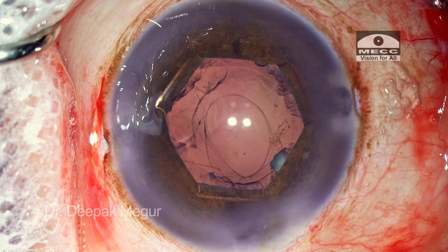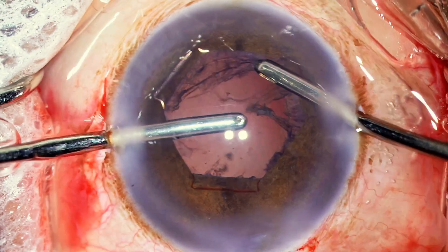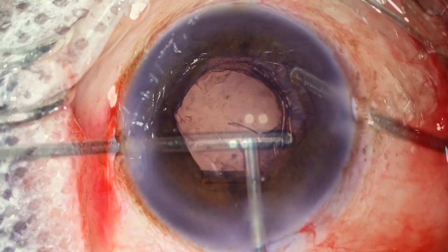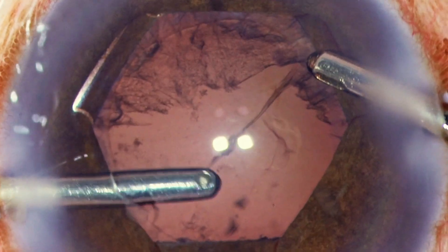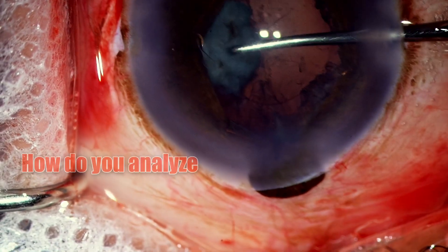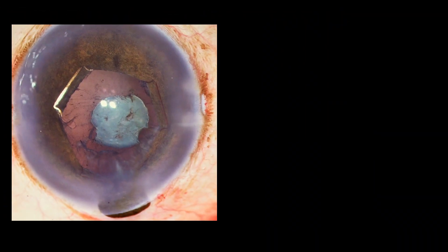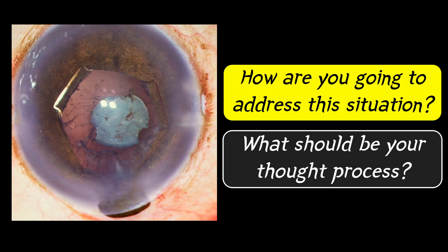Let me pause here and analyze how things went. Whenever we have significant intense positive pressure, what would you have done? For this surgeon, this was unexpected — and this is when your preparedness matters if you're aware of such situations and have seen someone else undergoing them. This is a very stressful situation: significant positive pressure, an uncooperative patient, literally no space in the anterior chamber, and just one last fragment to be emulsified. How do you analyze this difficulty, and is there a way to work around this problem without causing the posterior capsule tear? What should be your thought process when encountering such a situation with positive pressure?